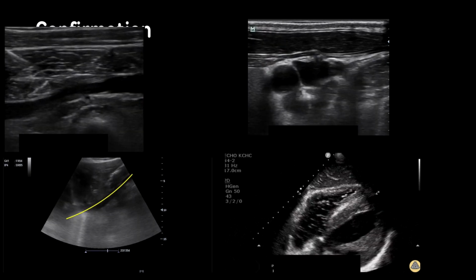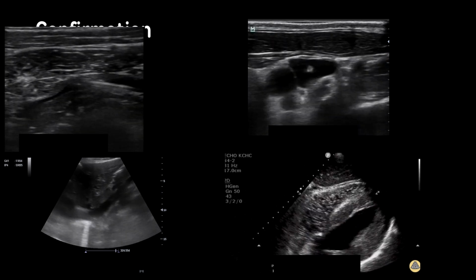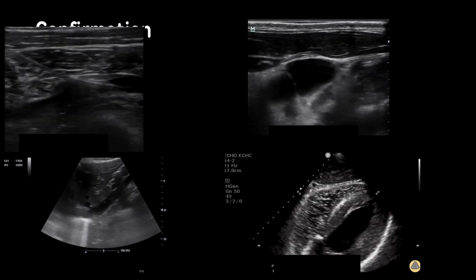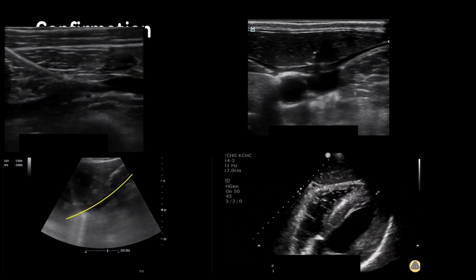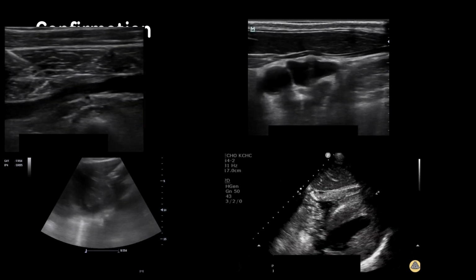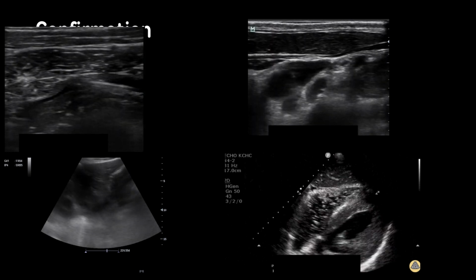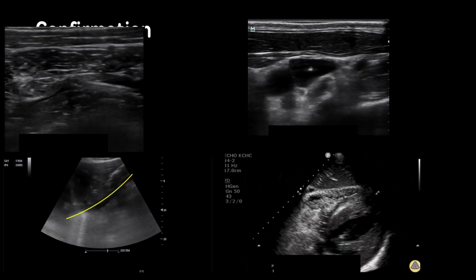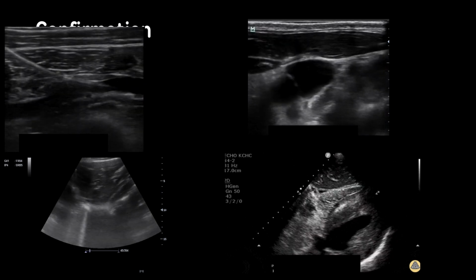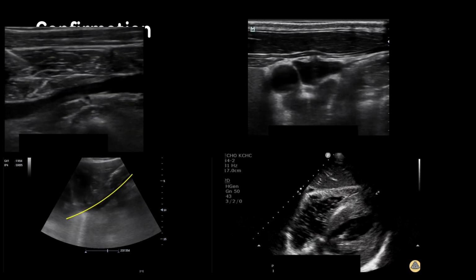Then look, I'm not in the artery. So I can't stress this enough. Please make sure your lines you're in the vein. But then it's too late. I mean, this one? Yeah. What do you mean you're too late? This is true. Yeah. No, this is true. That's why wire is the way to go. Before you dilate, check again. You've got the ultrasound. Make sure you're in the vein.